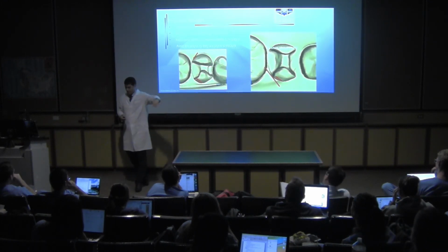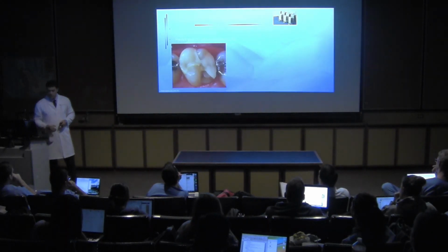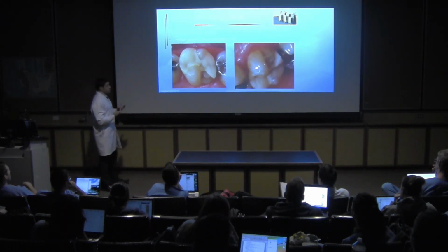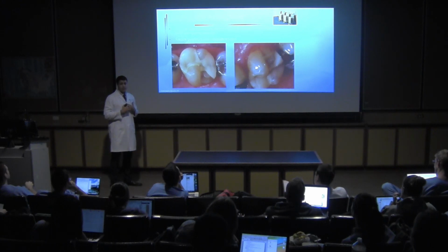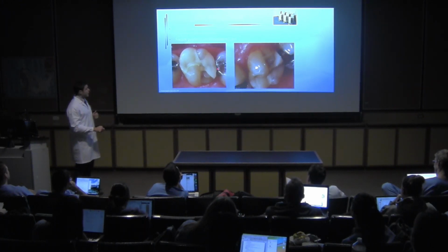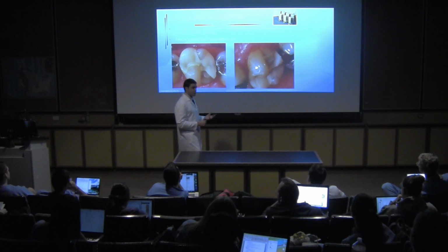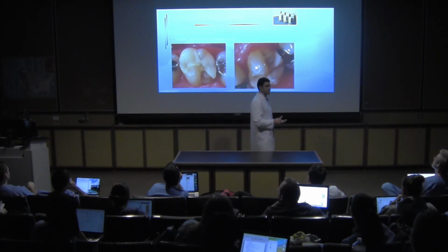Okay? If we don't reduce the tooth enough, this kind of fracture definitely will occur. It will happen.